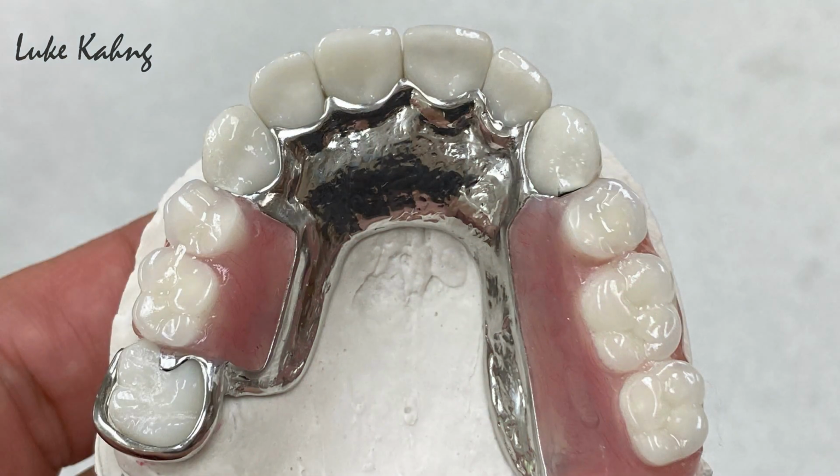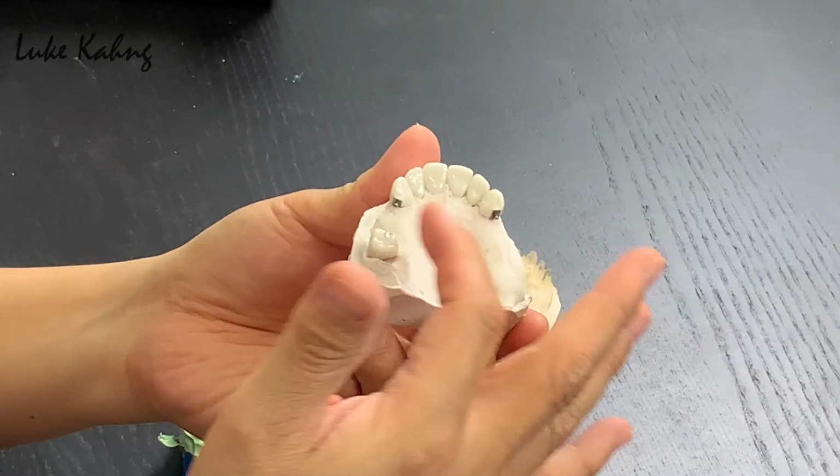So this is an important moment. We send the old crown out to the dentist. Okay, I made a mistake sometimes, or the dentist made a mistake too. We all the time recommend, I need the crown back from the dentist, which means the doctor has to try it in the patient's mouth, and then take the pickup impression. Really good. Before doing that, here's the attachment. They have to make a good sleeve. Depending on the company, there are several companies out there, Preat and Zest, those kinds of companies, you can order it. Carefully seat the sleeve, and then take the impression.